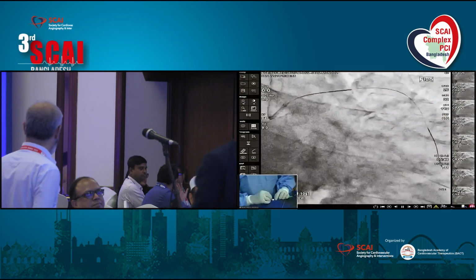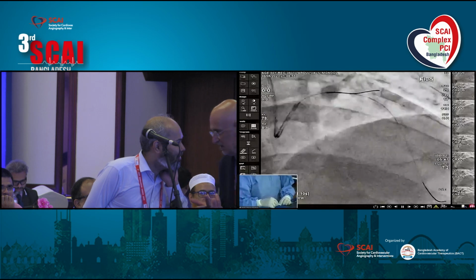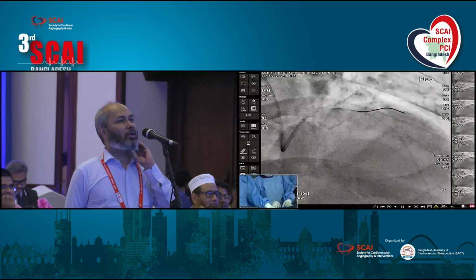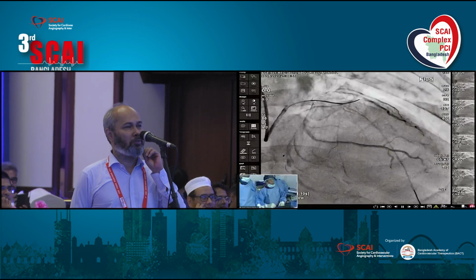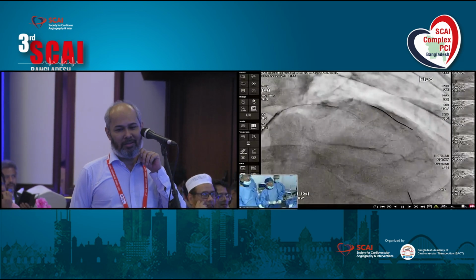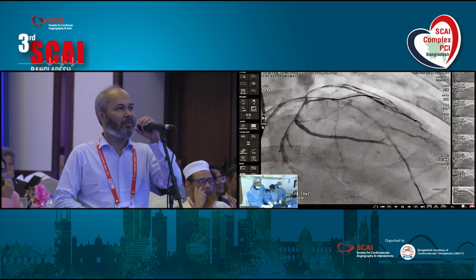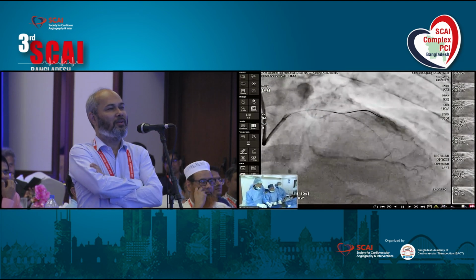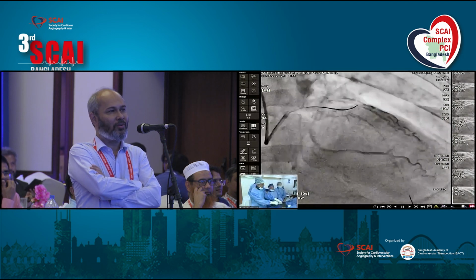Okay, go to cranial. Cranial, just one wire. Actually, what Imad wants to say is that it is not actually a bifurcation lesion. Yeah, it's not. I mean, just because of the angle that it is coming off. If you're going to cover that area with a stent, it's probably better to be safe than sorry. And that's the only reason we are just putting a wire and that's a run through.